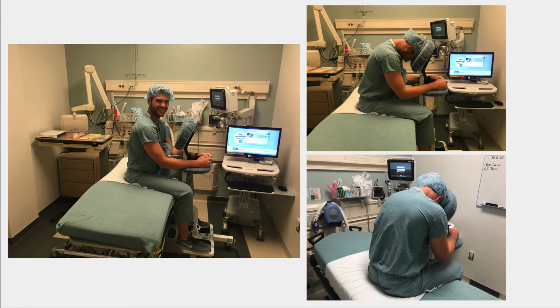These foot rests can go up and down to make sure that the chair is adjusted for the patient's height. And unlike regular massage chairs where you actually put your face in this, you really just want to put their forehead. By doing this, it will help round their back out, as Tyler is demonstrating here. One of the assistants, whether it's another resident or wonderful nurse practitioner Sione, will stand here to help the patient round their back out, to make sure that they're comforted and they know what's happening the whole time.